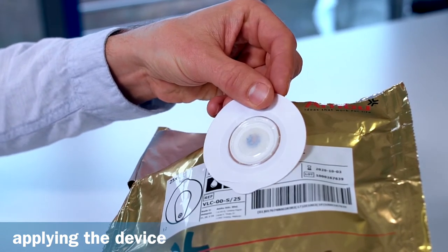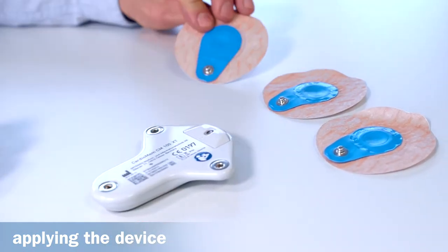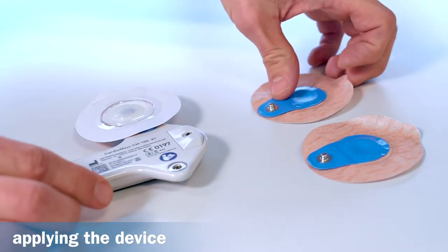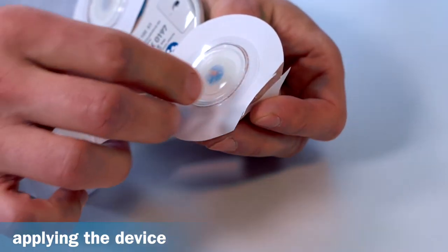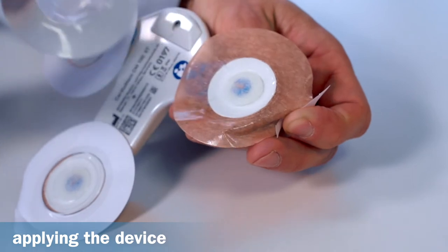To attach the electrodes, proceed as follows. Place the recorder face down on a flat surface. Take three new disposable electrodes with their protective film still attached. Snap the electrodes into the connections on the back of the recorder. Carefully remove the protective film from the electrodes and avoid touching the gelled surfaces.